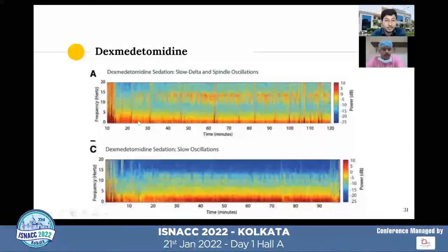Now coming to dexmedetomidine, the signature is dose dependent. This pattern shows at a lower concentration, at around 0.6 microgram per kilogram per hour. Here we can see delta oscillations and other waveforms seen in 10 to 15 hertz. This pattern looks like that of propofol alpha oscillation, but it is not propofol's alpha oscillations. These are sleep spindles. In the propofol signature, those frequencies are continuous. Here it's not continuous. These sleep spindles last for 1 to 2 seconds only. So this is a signature of dexmedetomidine at around 0.6 microgram per kilogram per hour.